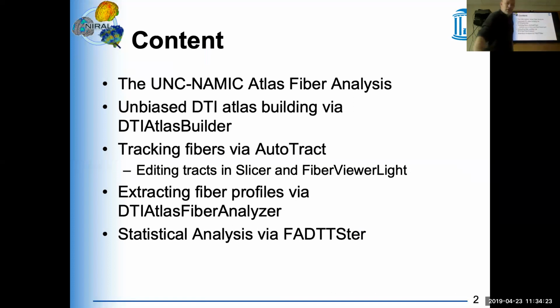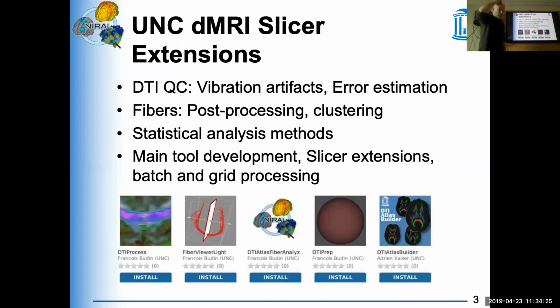All right. Most of these tools that we developed as part of this NAMIC toolset are extensions in Slicer. So unfortunately, every time there's a new Slicer version, even subversion, we have to go in and change our extensions. So you'll see if you download a specific version, some of these extensions are there and other ones are not there because we need to go and update them. We found it actually to be rather cumbersome to keep these updated.